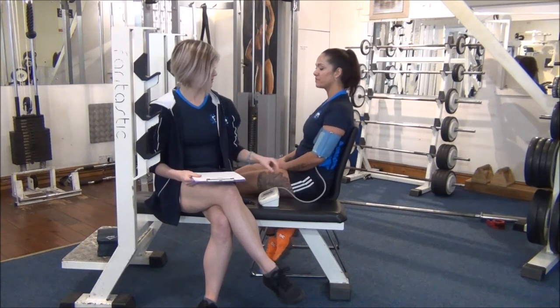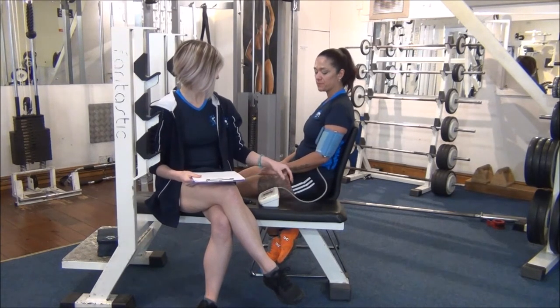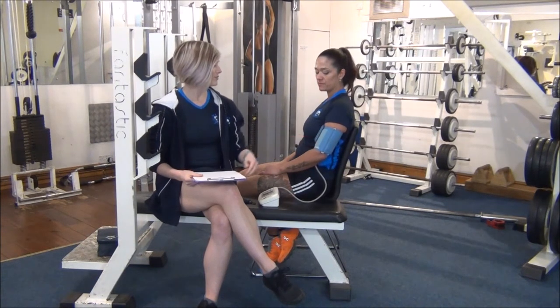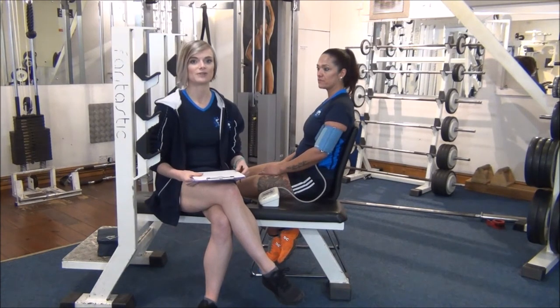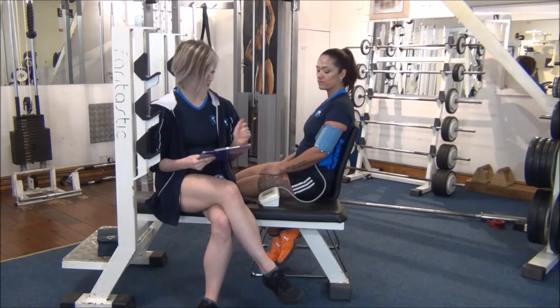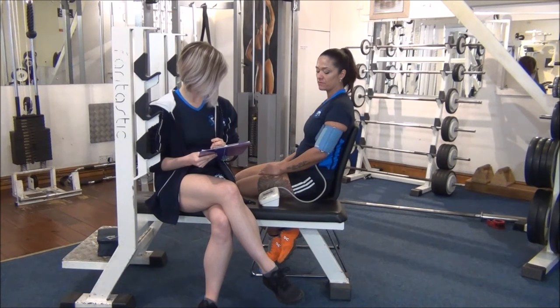Once they're nice and relaxed, you just press the start button and it's going to tighten. This is going to start to increase and then you should hear a beeping noise when it's starting to relax again. It's just dropping down and I'll be able to write down the results in a second.